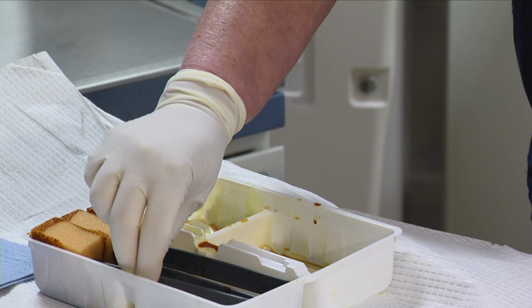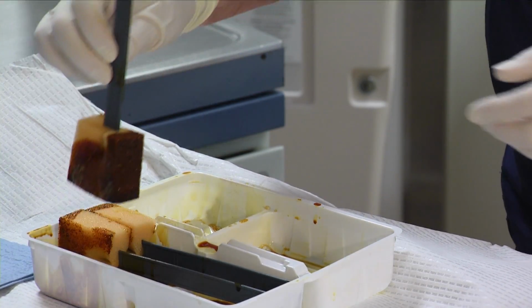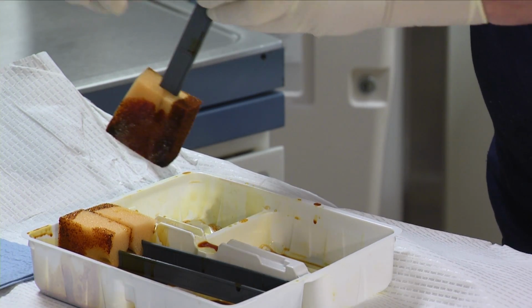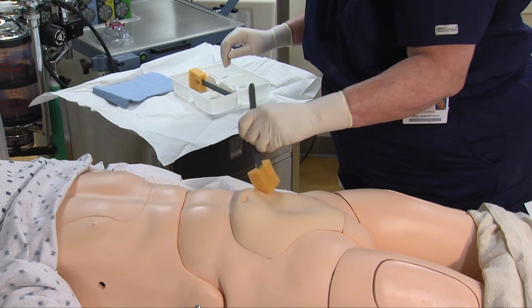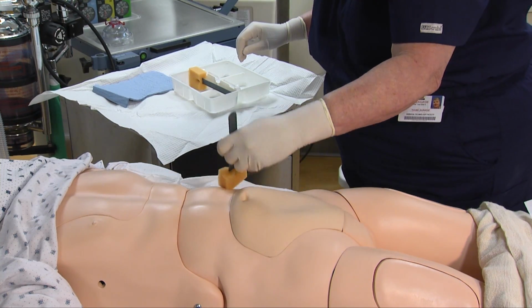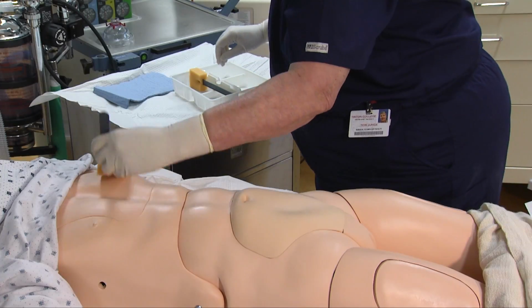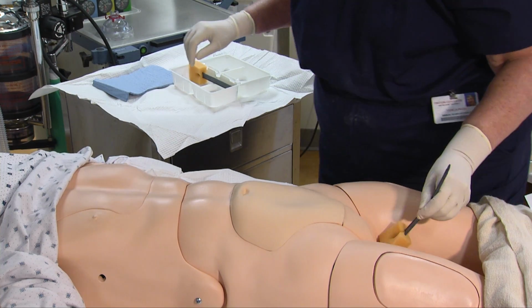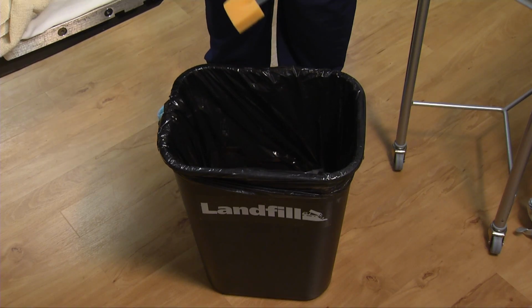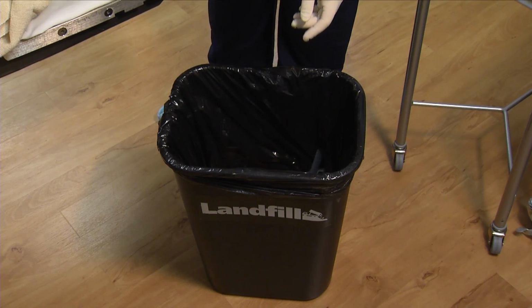Use your non-dominant hand to secure one of the handled sponges soaked in the paint solution. Transfer the sponge to the dominant hand, hold the handle so that your gloved hand does not come in contact with the patient's skin, and begin to paint the prescribed area, starting at the intended incision site and working in concentric circles until the perimeters of the prep are reached. The groin is the last area to be prepped with each sponge. Each sponge is discarded after use, and the procedure is repeated until all sponges have been used.